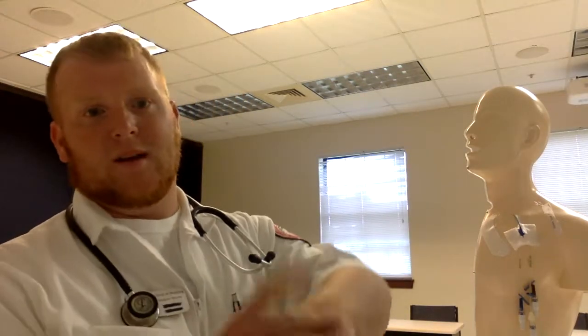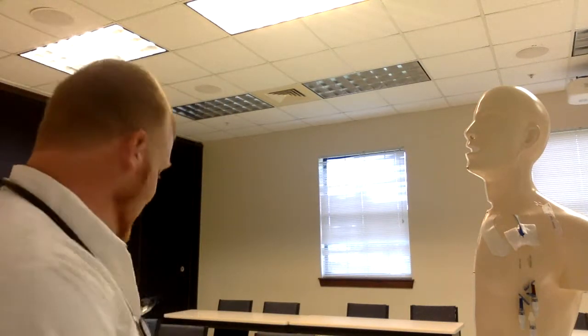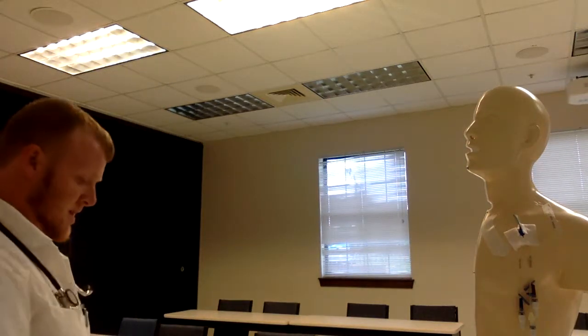When we walk into the room, we make sure to wash our hands and introduce ourselves so the patient feels comfortable. Who are we, and we also need to verify that this patient is who they are. To do that, we can ask the patient to state their full name and date of birth, and verify it on their armband. First off, I wash my hands. I'm going to put on some clean gloves, not sterile, even though this is a sterile procedure, for certain parts of it.